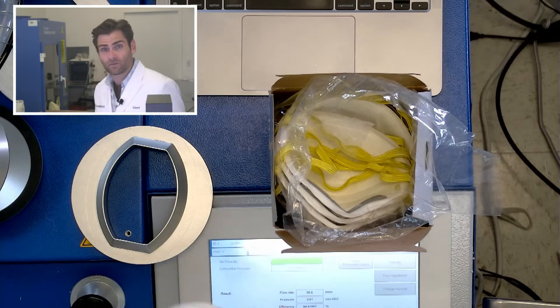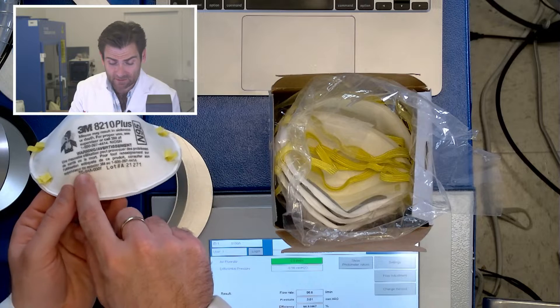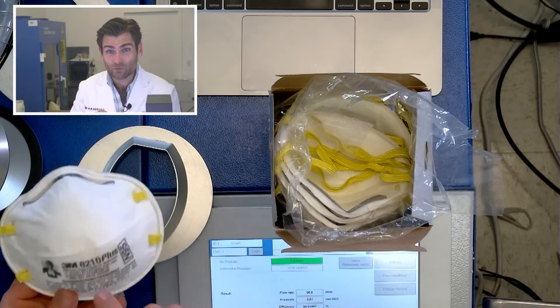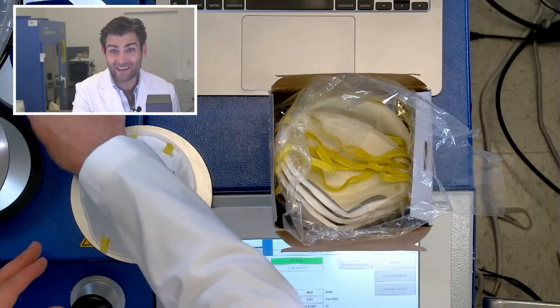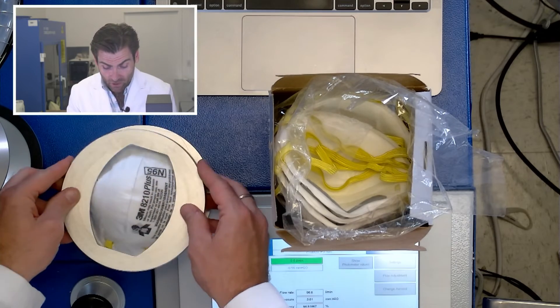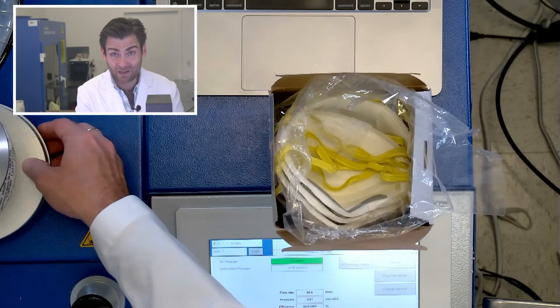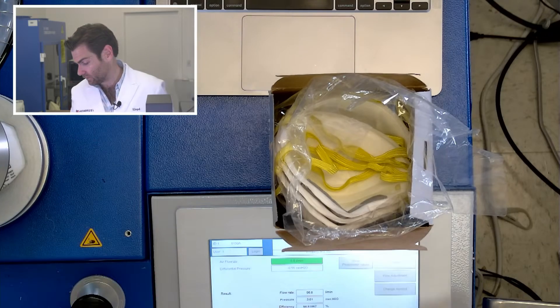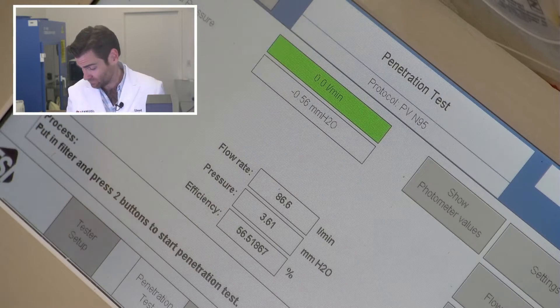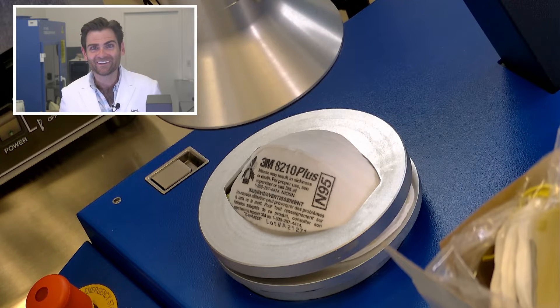Every NIOSH mask has a TC number. You can go to their website, type it in, and see pictures of the mask to check if it's a fake or if it's still active. They secretly buy and test masks — that's a real commitment. I've heard the Korean FDA does the same thing. You really have to police manufacturers, because guys like me can be sketchy.